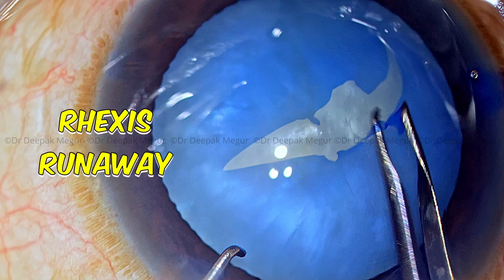We have a rhexis which is very much enclosed, and now it's time to decompress the bag. I'm going to use the bimanual irrigation-aspiration system to debulk the lens by aspirating all the swollen cortex — both in front of the nucleus and in the equator and posterior to the nucleus, just by tapping around. It's important to decompress the bag thoroughly before attempting the secondary rhexis. Once the bag is adequately decompressed, OVD is placed into the eye, a tangential cut is given with the micro scissors, and using the forceps the secondary rhexis could be performed quite easily. The moment we have decompressed the bag, the rhexis becomes a child's play.